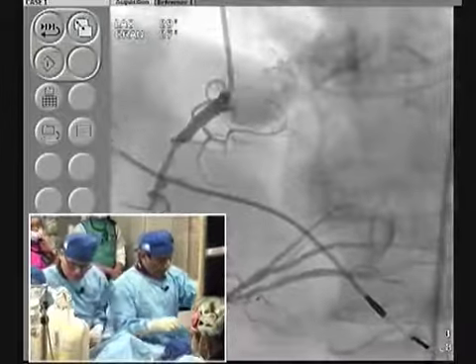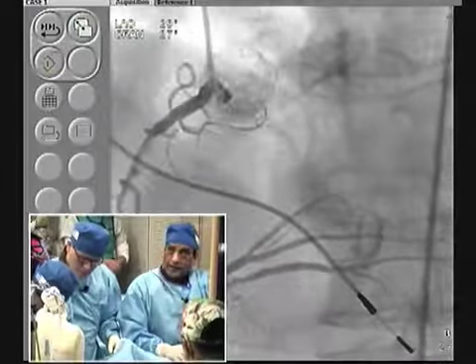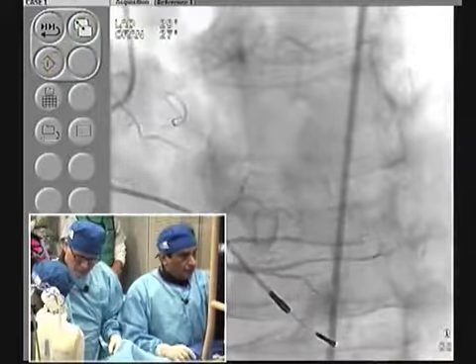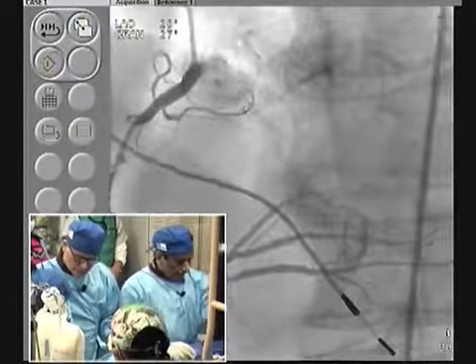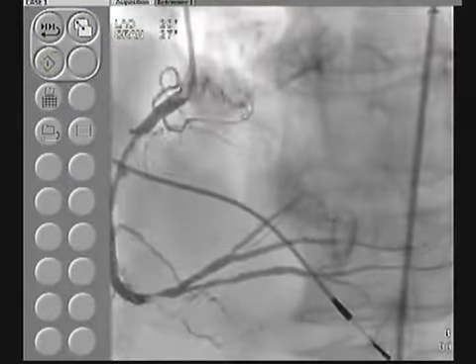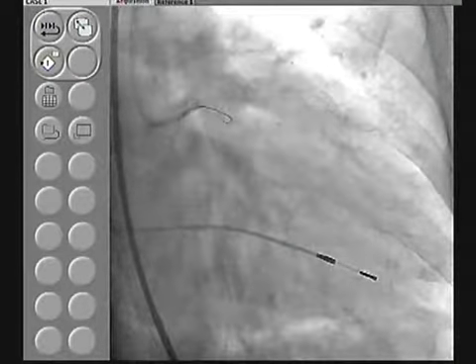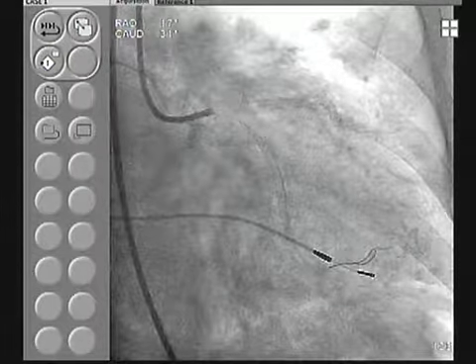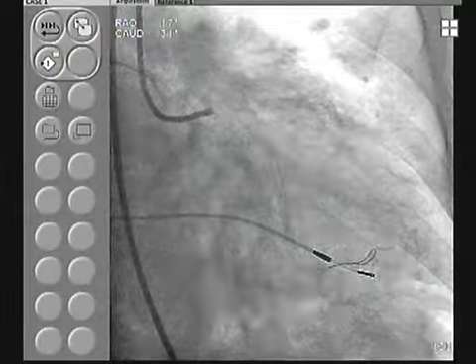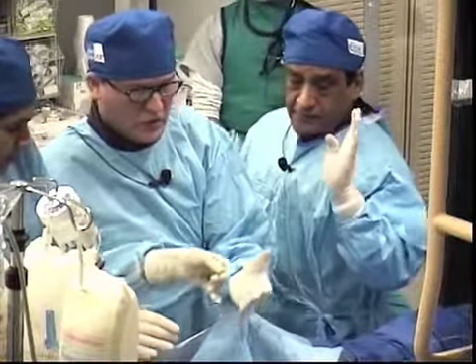So in this particular case, our goal is rotablation proximally. I don't think distally we needed rotablation. Just do a PTCA and then put a stent across, and then one stent in the RCA. Having said that, our goal today was just to show the new technology, so for the right you'll probably use the 175 rotablator, and 2 stents. It may require a bigger burr, but the same approach.